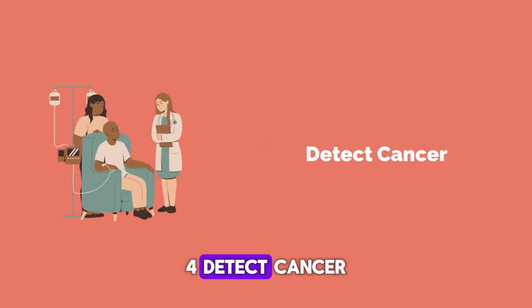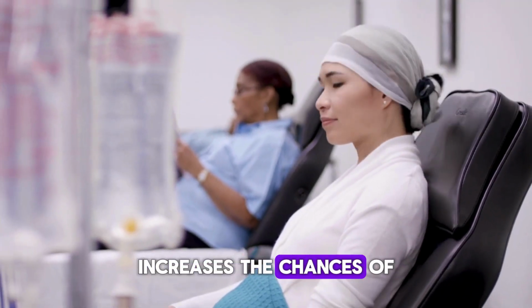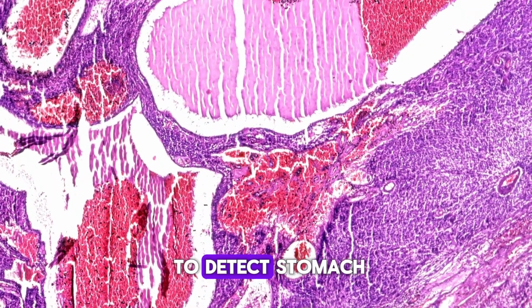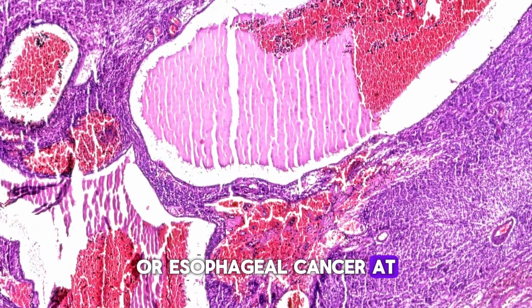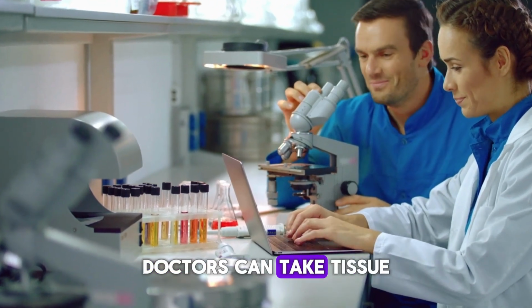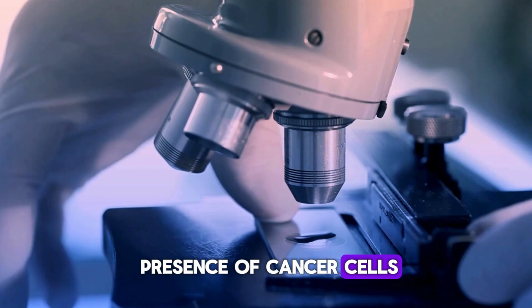4. Detect cancer. Early detection of cancer significantly increases the chances of successful treatment. Gastroscopy can be used to detect stomach or esophageal cancer at an early stage. During the procedure, doctors can take tissue samples for biopsy, which can confirm the presence of cancer cells.